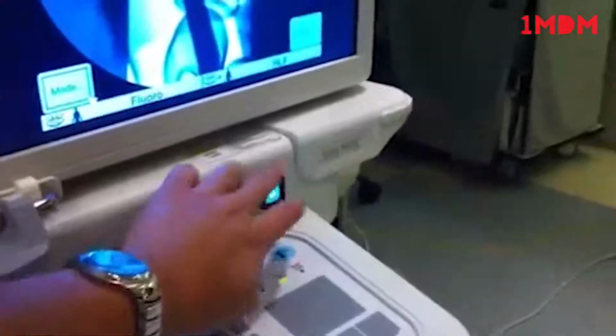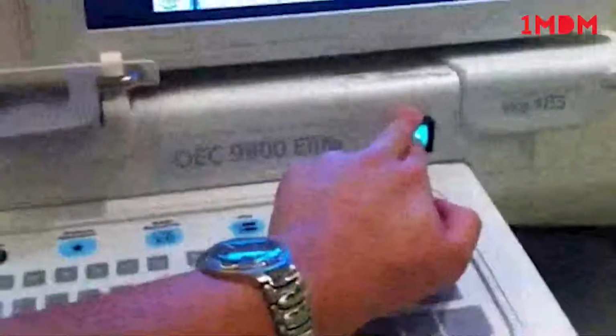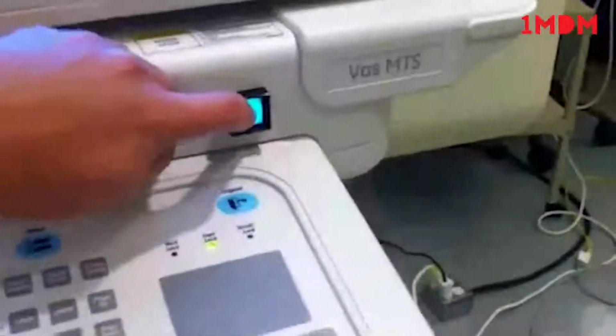When you take the C-arm out for storage, let's turn off the machine now. If you're running an older C-arm, particularly a 9800 or 9600, you want to wait about 1 minute after doing any of the saves or any system functions before you turn it off. Otherwise this can result in hard drive failure or data loss. There's a little tag there that says that, but you can turn it off here. It'll tell you, don't unplug the machine. It'll shut down on its own.